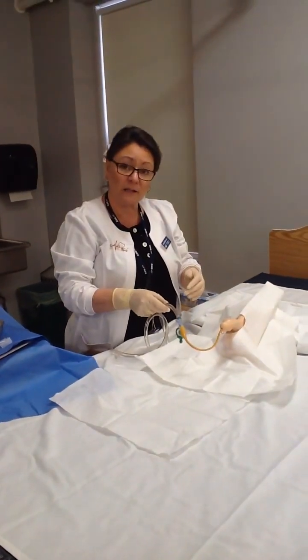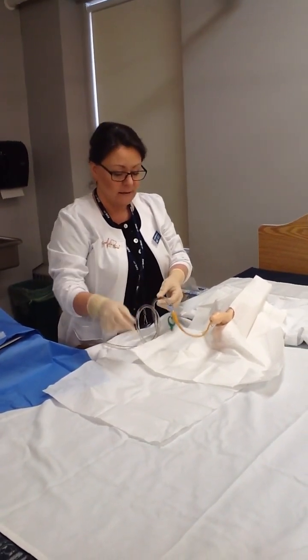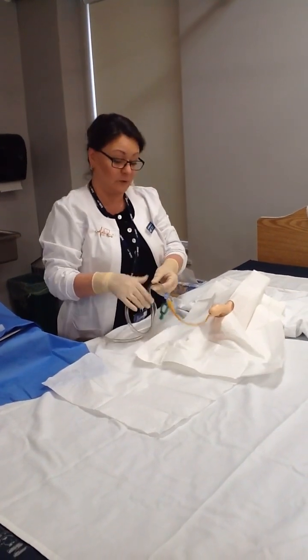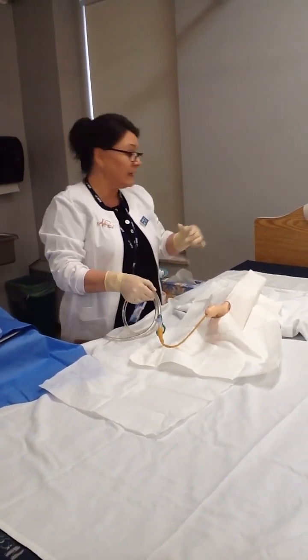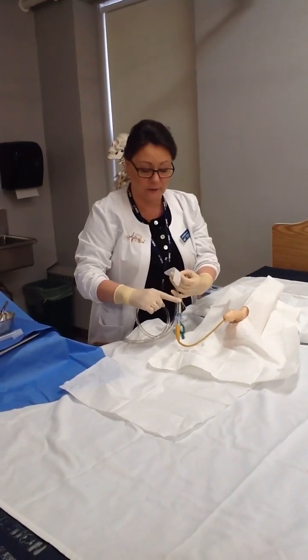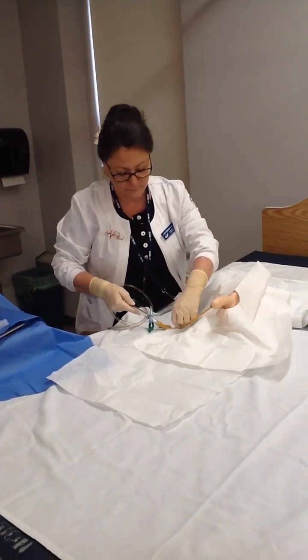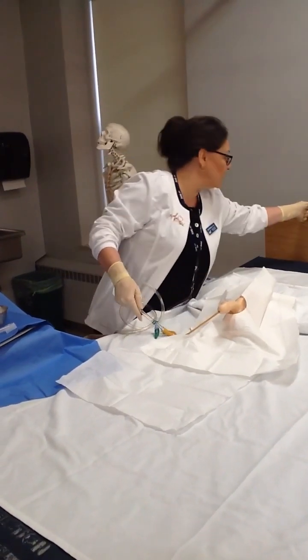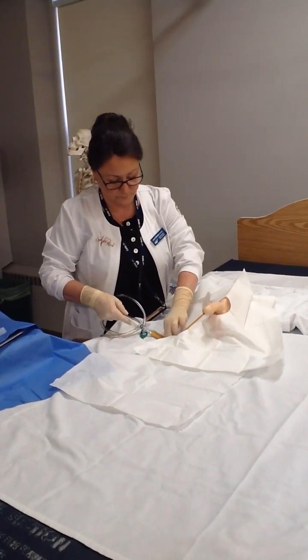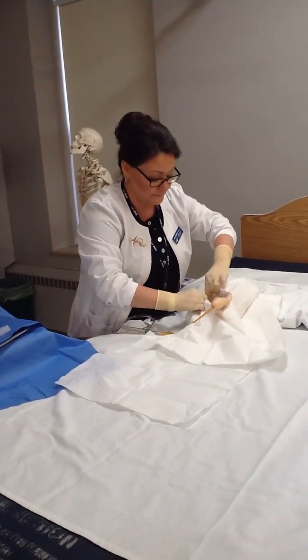According to agency policy, you're going to allow the bladder to drain completely before you connect that. And I have a couple of pieces of tape here already. And I would secure the catheter, not the tubing, the catheter, to the patient's thigh. And then I can tear that fenestrated drape.